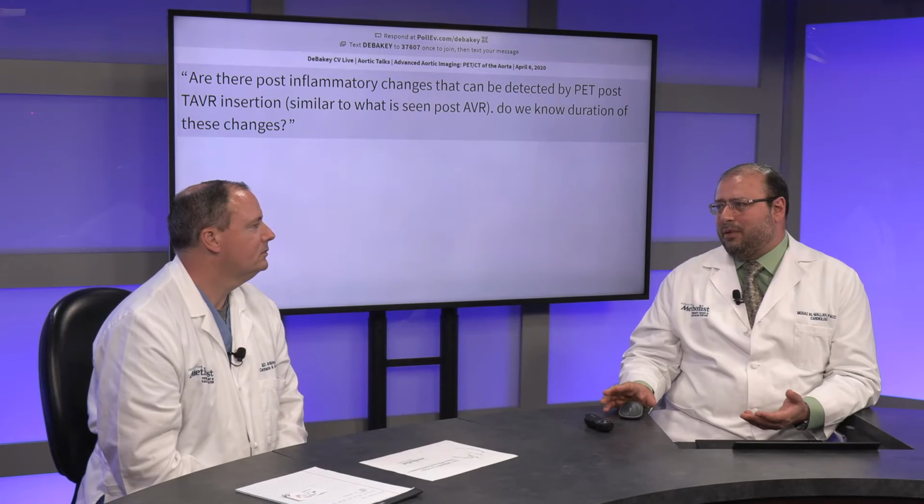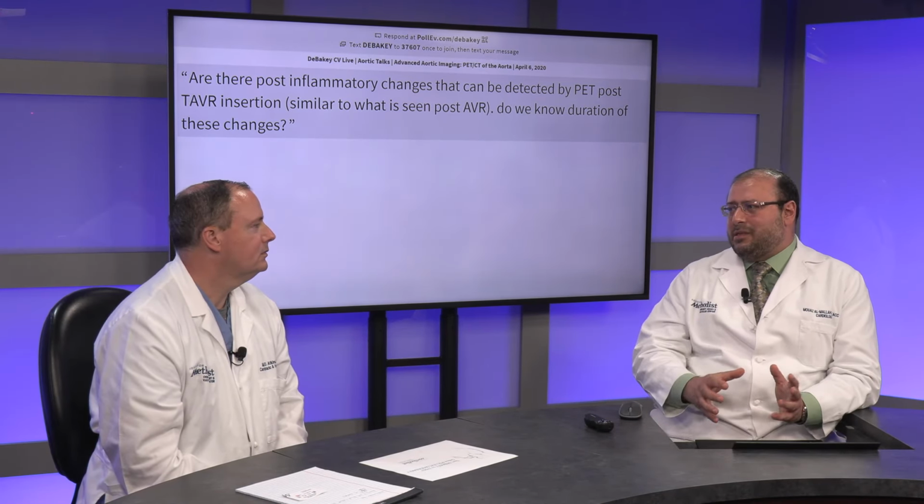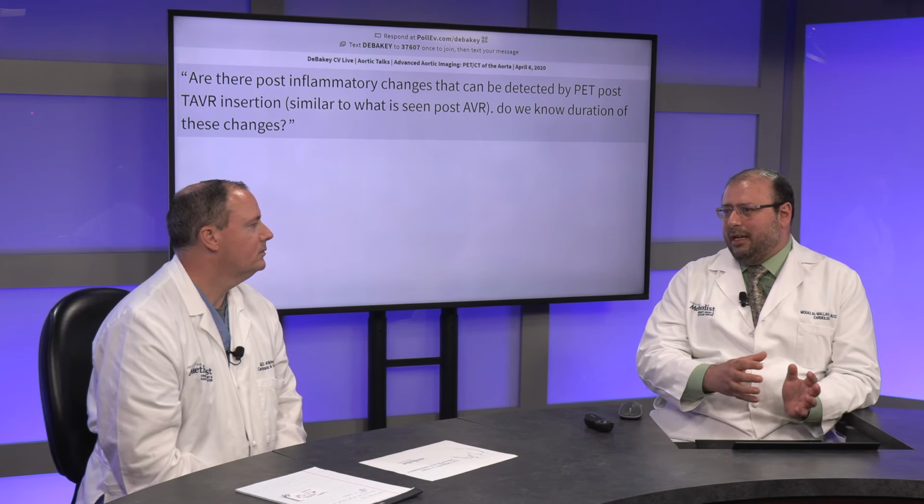There are also situations like renal failure where you cannot give contrast. And obviously claustrophobic patients, although these can still be treated and prepared for the scan, I would think they are more suited to PET than MRI.